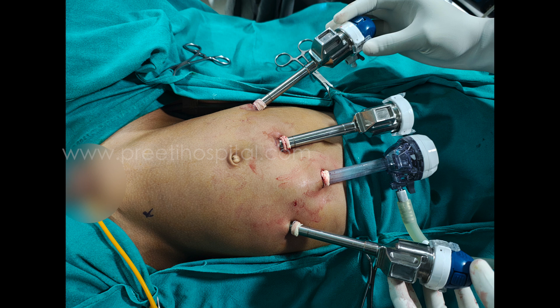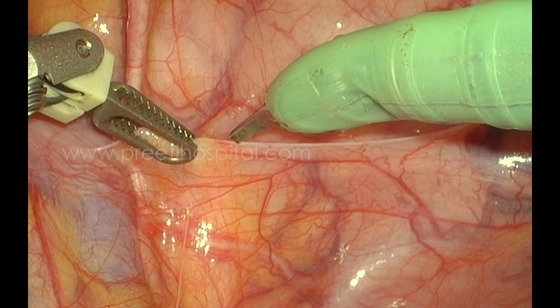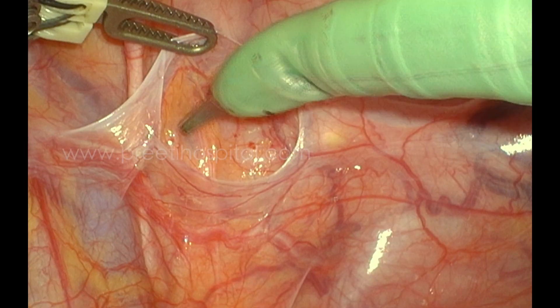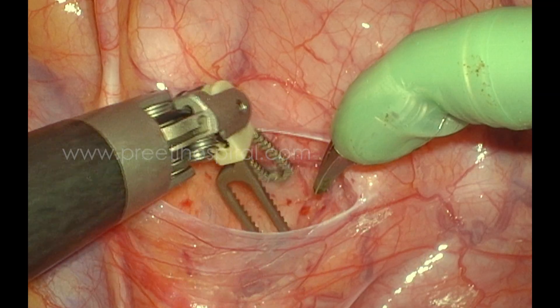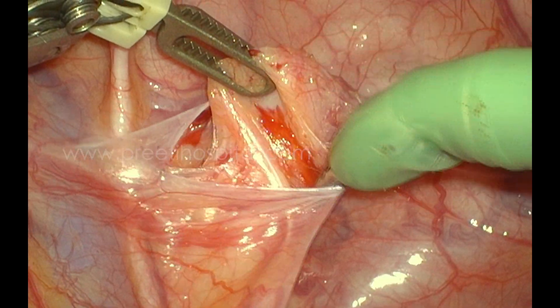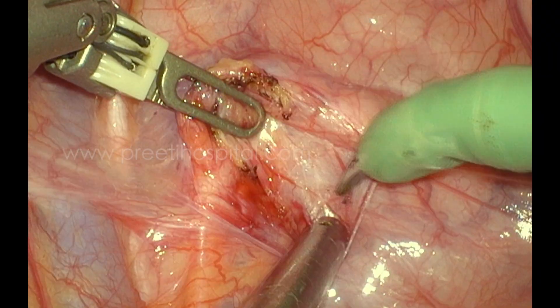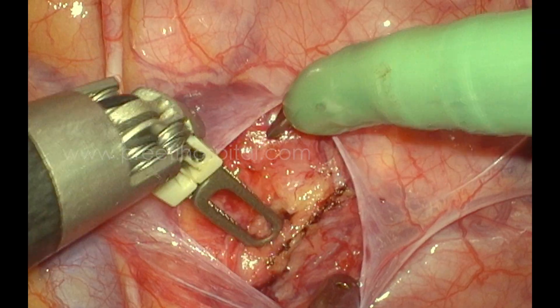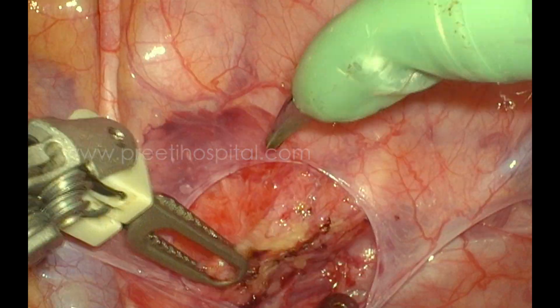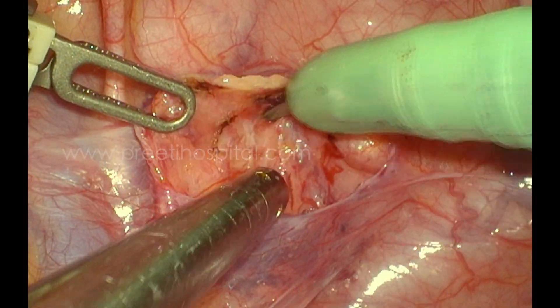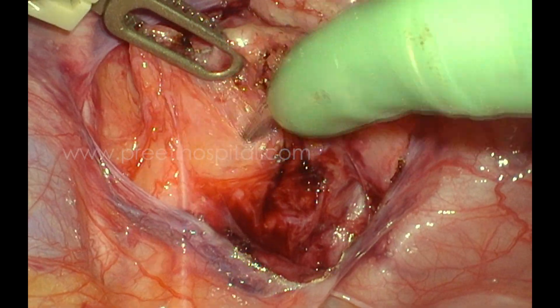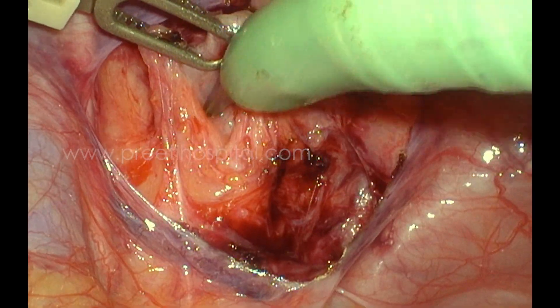During robotic surgery, we identified the diverticulum directly on the suspected area — lateral on the left side, lateral to the Foley balloon. We identified that the vas deferens is pushed down posteriorly. Once we began dissection, the patient was kept in lithotomy so that a ureteroscope could be inserted into the diverticulum.